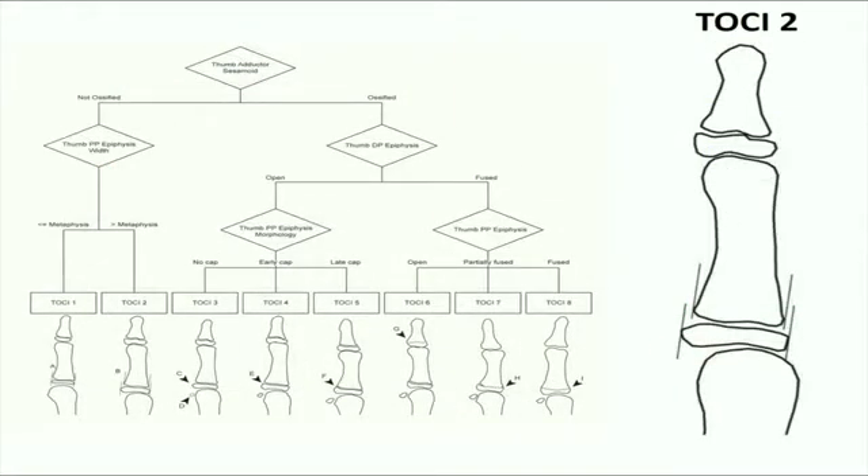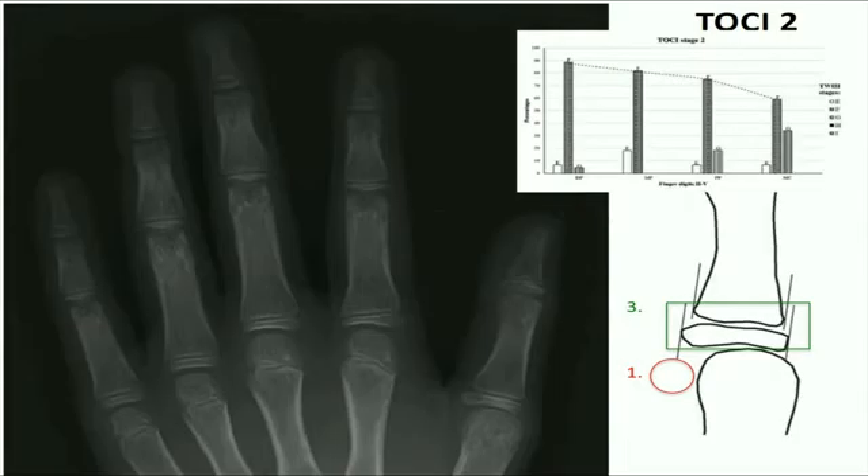Now for TOSI stage 2. Again, the adductor sesamoid is not yet ossified, and the thumb distal phalangeal physis remains open. The next step is to assess the thumb proximal phalangeal epiphysis, and we can see that the width of the epiphysis is wider than the metaphysis. This corresponds to Tanner Whitehouse stage F — in other words, covered epiphysis. In our cohorts, we found that 76% of the remaining four digits' epiphyses belong to stage F as well. This is the prepubertal stage.